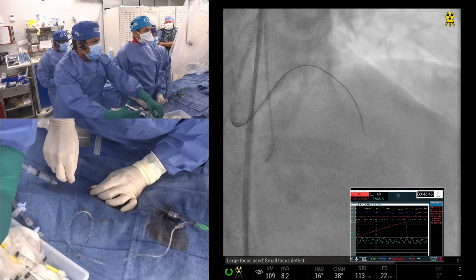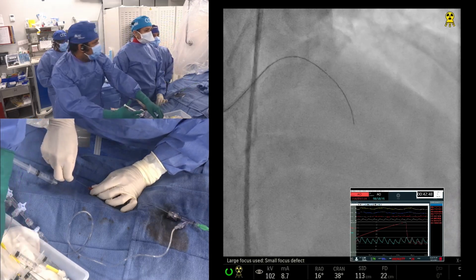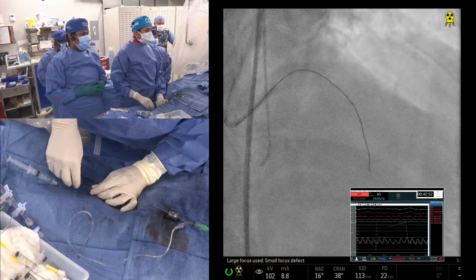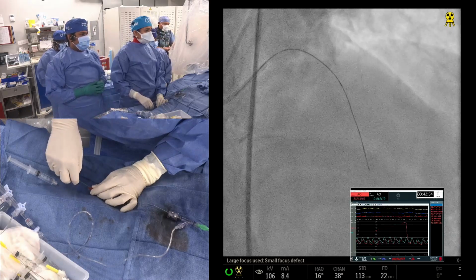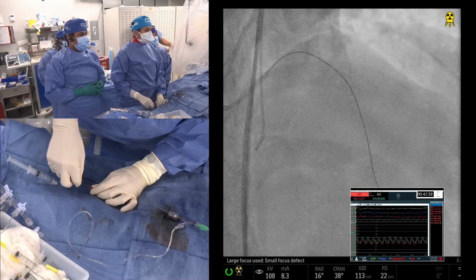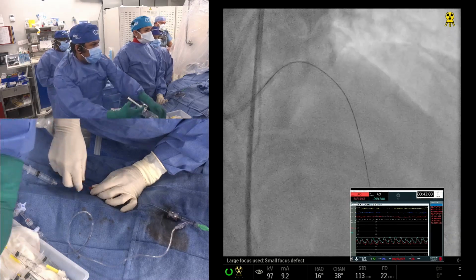No, it looks good. Good. And remember, any of this, your own individual class 3 would be epicardials. Yeah, that's right. Okay, now you can take the injection and you'll be good.